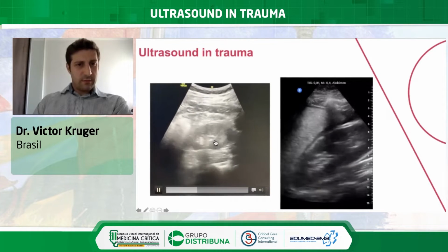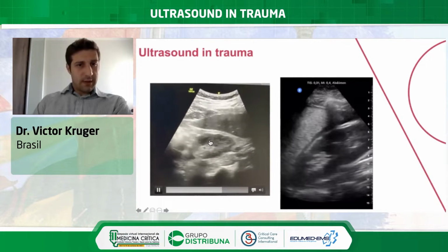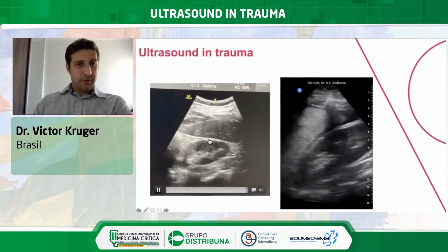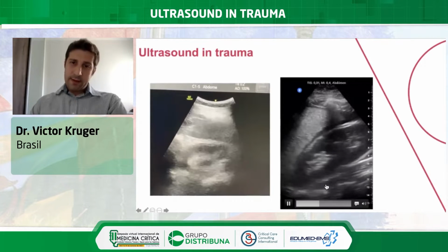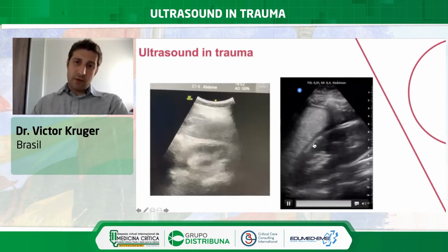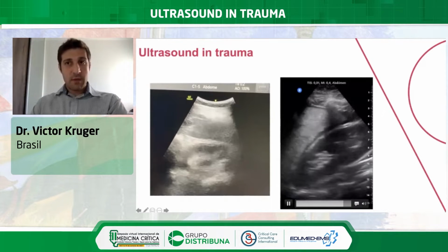In this video, it's a normal kidney, liver, no free fluid. In this video, the kidney, liver, and the presence of the sharpened black line, free fluid at the abdomen. Diagnosis. Free fluid, the diagnosis is a FAST positive.